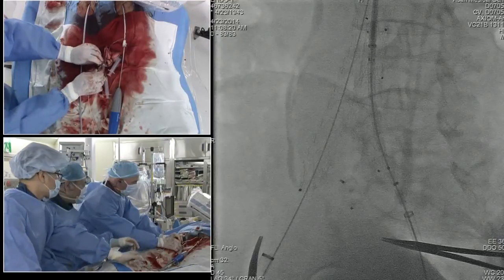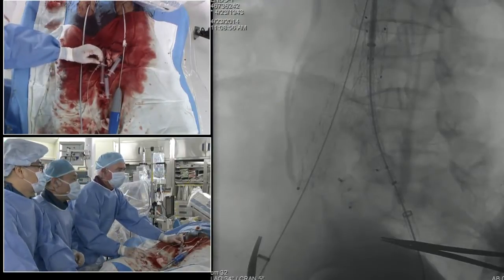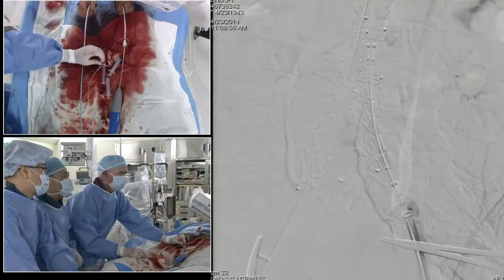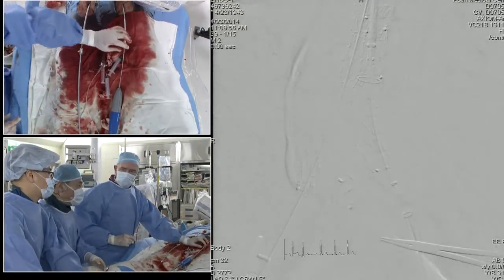I'm going to just backbleed this a little bit, make sure we're okay. Okay, good. Ready? Inject. Boy, that's right on it. Yeah. Probably a little too close for comfort there, huh? Maybe. Let's roadmap that, please.